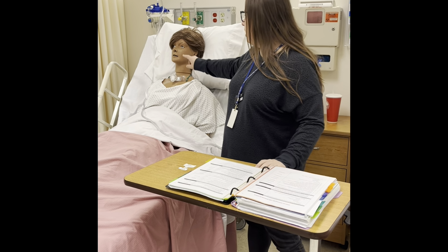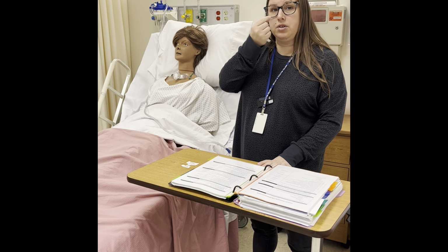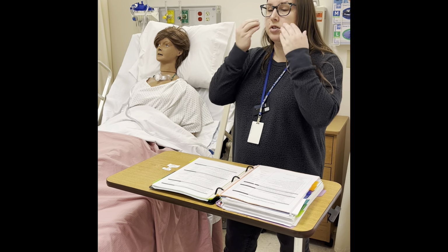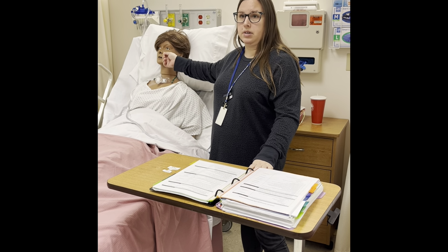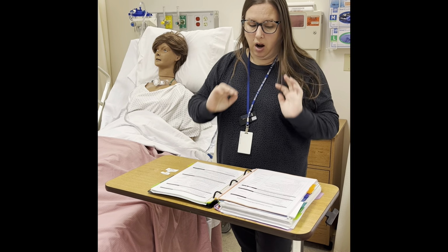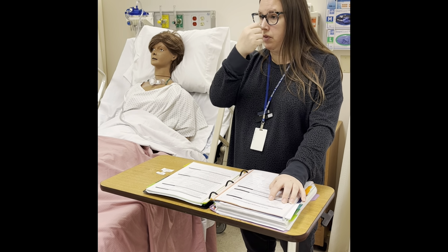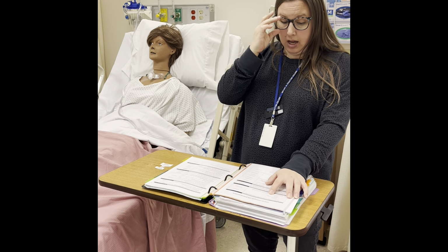Nasal polyps. So we want to know, are there little pouches of tissue that are going to make it difficult for us to pass that tube through the patient's nose? The other one, chronic sinus infections. People that have chronic sinus infections, sometimes those nasal passages are swollen, again, making it difficult for us to pass the tube because something on the inside may make that passage hard to go through. Orofacial or sinus surgeries. Again, if somebody had a nose job, it might be difficult for us. The anatomy might not be the same anymore internally, that we can't see.